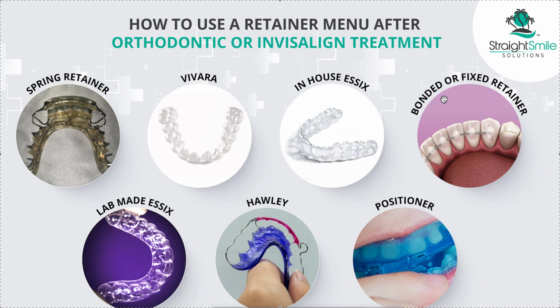If you see shifting or breakage within 30 days, you must contact our office within 30 days and come into our office for an exam, and bring your damaged retainers with you in order to utilize the warranty, okay? Your doctor has recommended one set of the following retainers. Have a line, write down which one you recommend.